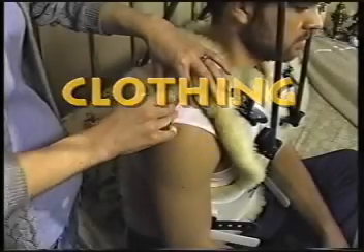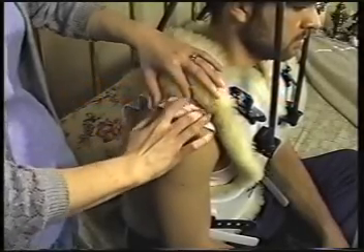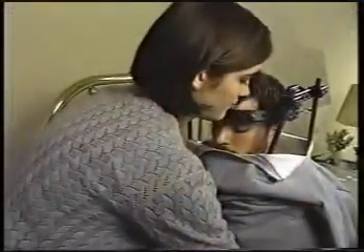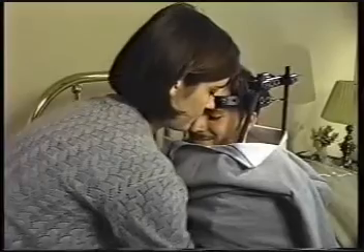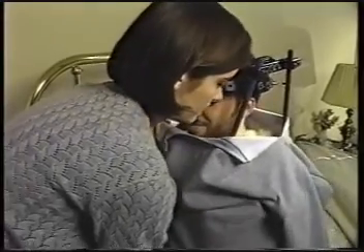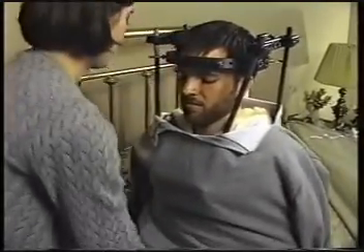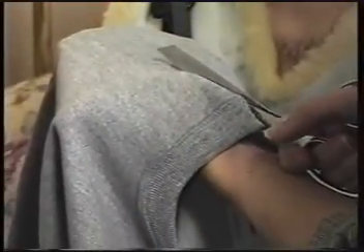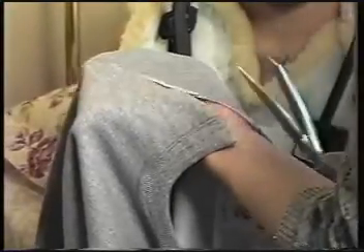You will want to wear a cotton undershirt under the vest to keep the liner clean and also because the liner is wool and may feel warm. It is easiest if you put Velcro on the straps. Your clothing needs to be large enough to go over the vest. You will probably be more comfortable in shirts that are a few sizes larger than you normally wear. Button-up shirts or sweatshirts work the best. Sometimes you may need to cut slits for a better fit. In cold weather, you will need an oversized coat and a couple of scarves to keep you warm.